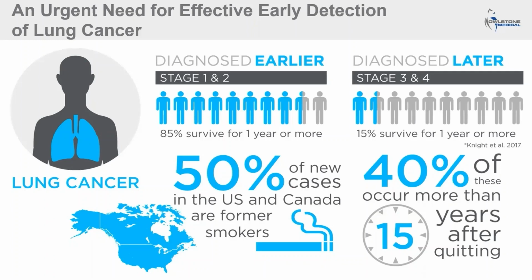Despite the large reduction in deaths, low-dose CT scanning still isn't widely used because of significant costs and a high rate of false positives, where most lung cancer nodules are deemed to be benign. Moreover, eligibility is limited to high-risk populations, mainly older adults with significant smoking history. An accurate non-invasive breath test could be used in combination with current risk criteria as a pre-screening tool to determine eligibility for low-dose CT scanning. It also has the potential to expand CT scanning to lower risk populations, including those who have never smoked.